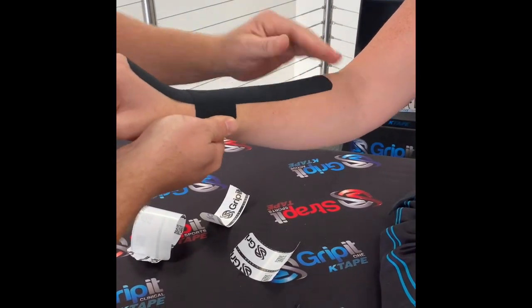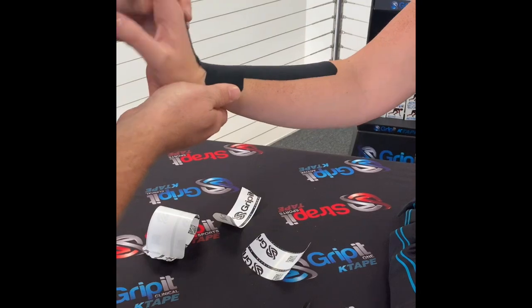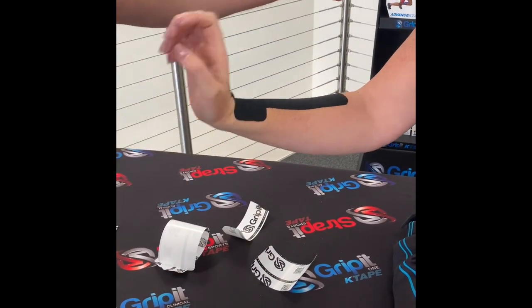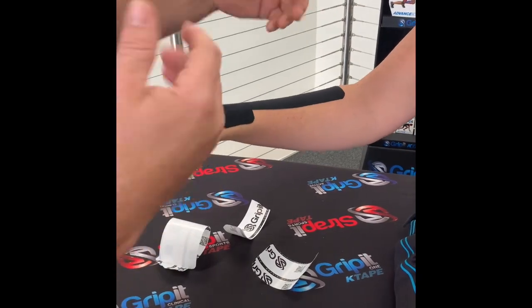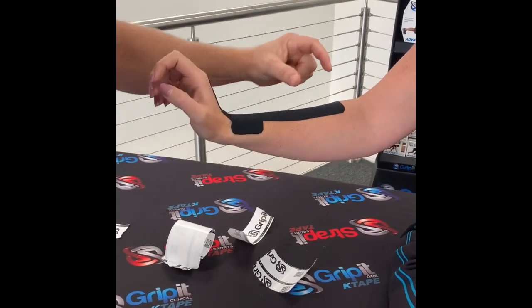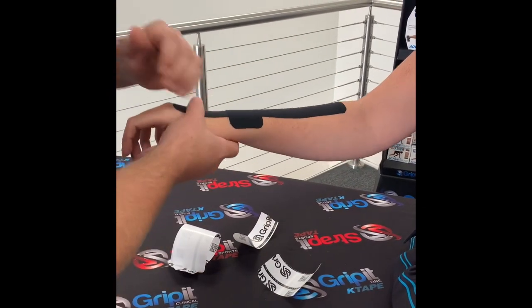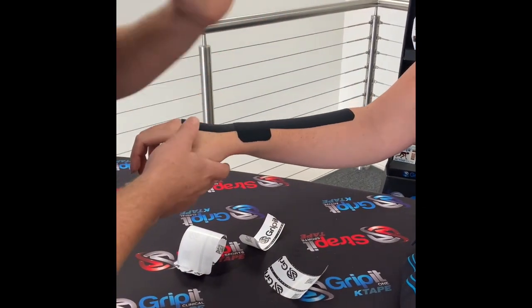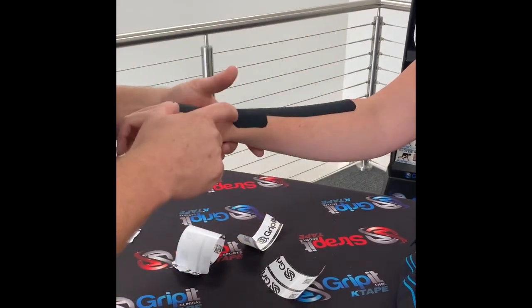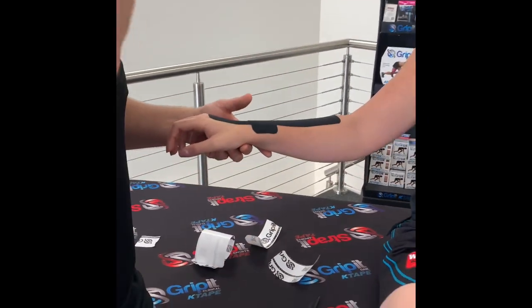And then Amy, for her wrist extensors here, has a fantastic bungee, yep, through full range where the tape's storing energy and it's releasing energy, so the system doesn't have to work as hard. But the biggest important thing is the anchors are long, no stretch on the tape, and that'll give you the best outcome for your patient and the less chance of skin irritation at the anchors. Fantastic, thank you.